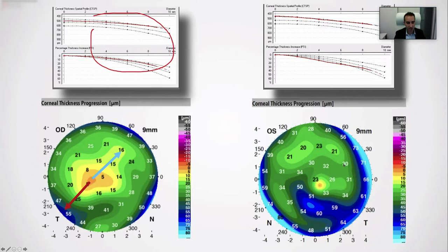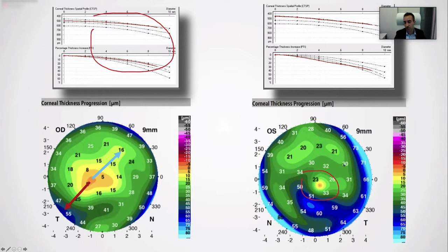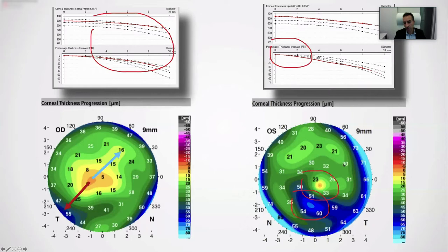Looking at the left eye, which is more severely involved, even though the progression is almost the same in the hemimeridians, if you look at the central one-to-two millimeter zone, there is a huge speed difference from the very center of the thinnest point down to one millimeter in radius — not picked up on the conventional map. There is another increase in speed at about four to six millimeters in diameter, visible on the visual map but diluted in the conventional representation. This highlights the importance of visual speed maps of corneal thickness.